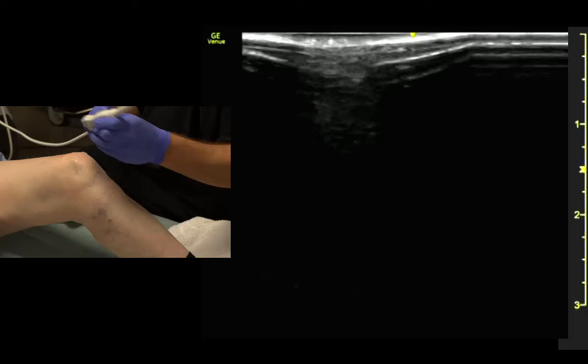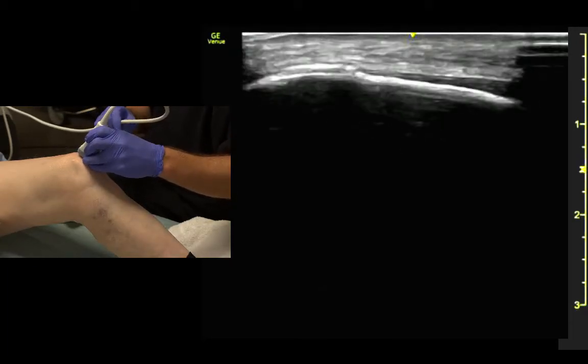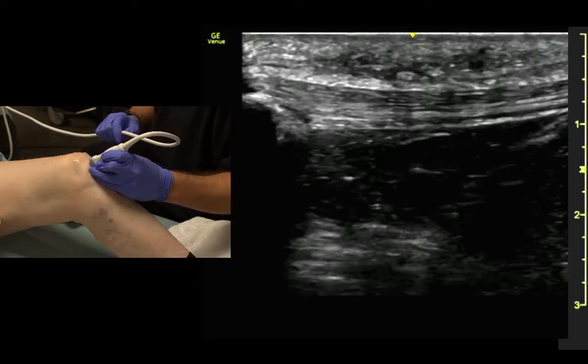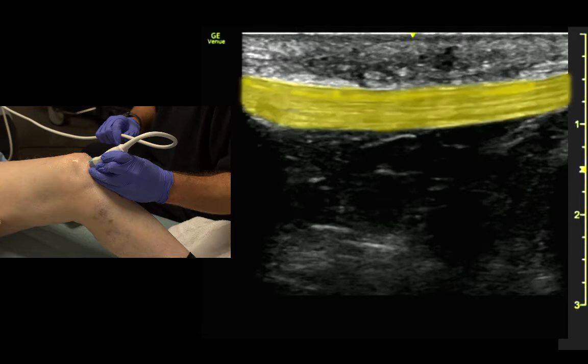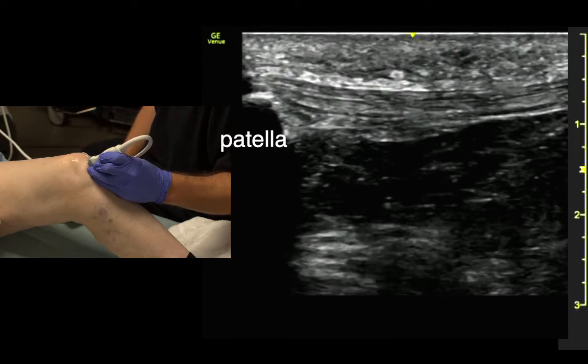For the patellar tendon, same thing, only we come down. We get right on the midline of the patella, slide below, and there we can see the patellar tendon coming off of the patella, lining up on the tibial tuberosity.